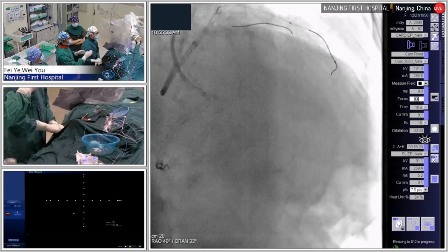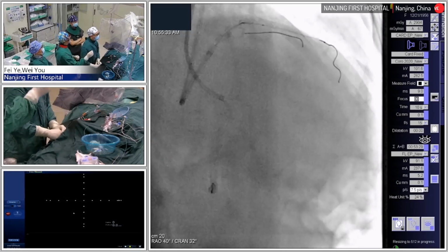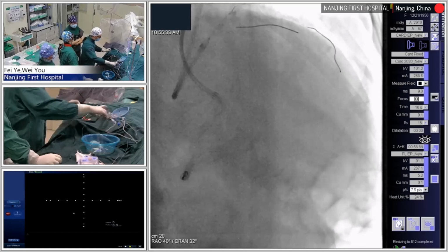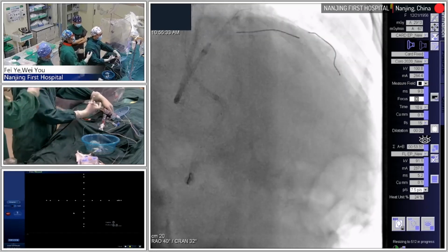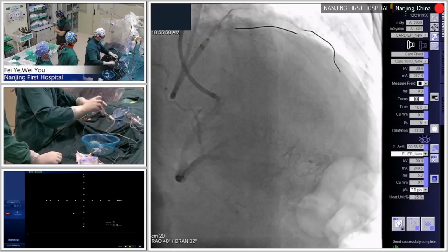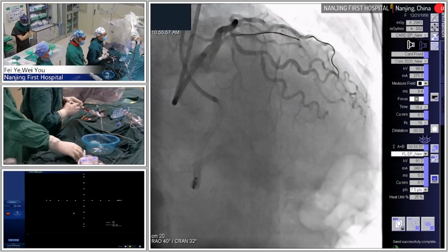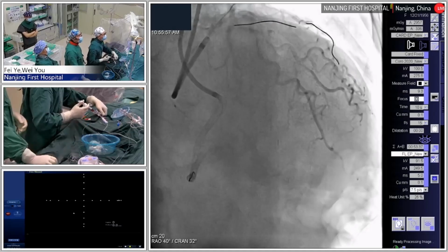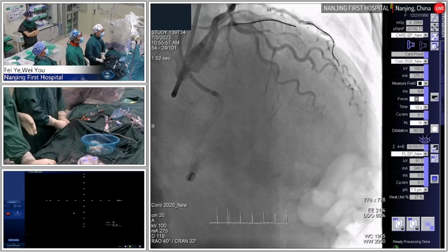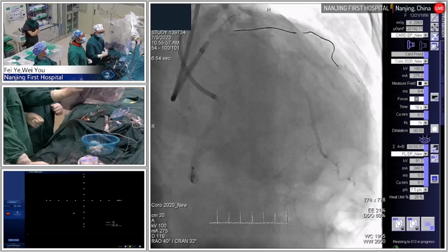After the RCA has good blood flow, I think the collateral branch to nourish the LAD will be good in a few months. Another option is to use the retrograde approach. Some people like to stage the PCI for LAD CTO after recanalization of the RCA first. If we wait several weeks, we can get good network from this RCA.